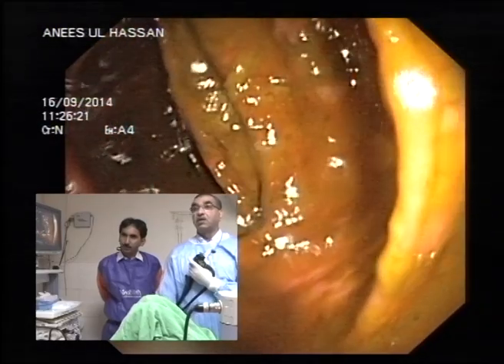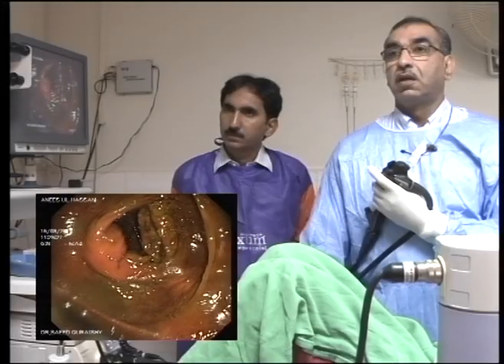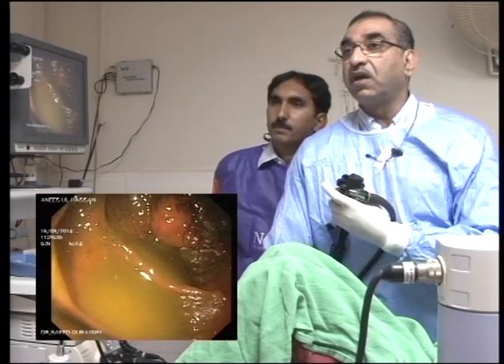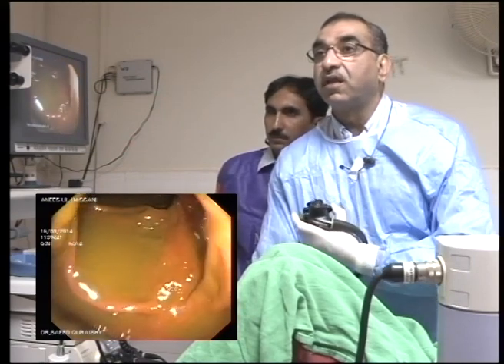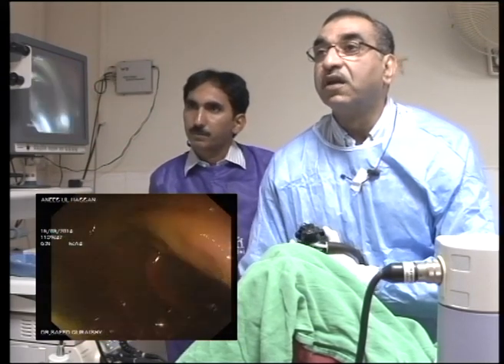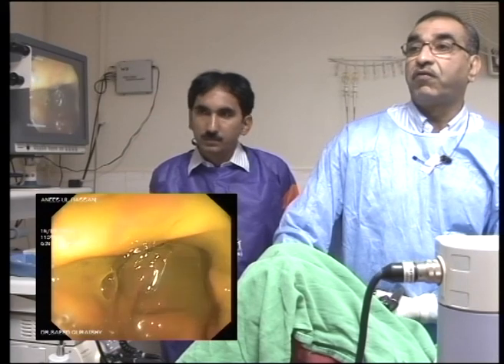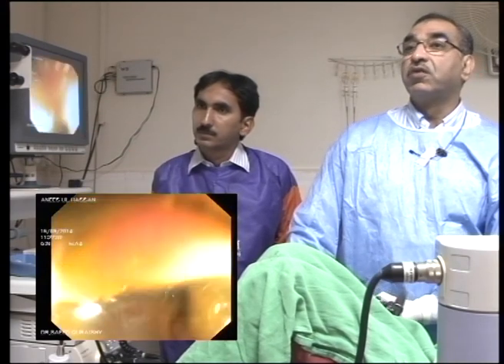And as we come out, right? So now this fold is coming in front of your field, right? So when you anticipate it's coming, you look away from it, and then this one. You've not lost any visual field there, right? And then if you are unsure, you can always go back. Now this is coming in front of your eye, so you move away from it, right? And then when you have cleared it, you come back over it again, and again it will come into your field of view. So you go over it again.